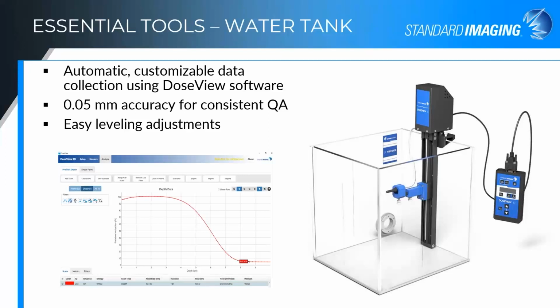Well, okay, so I have a question then. You said that with software, so do you need software, or can you tell me something about our software? Would go with DoseView? You don't have to use the software. You could certainly drive the chamber to the depth, align a surface, set your origin, drive it to the depth that you want to make a single measurement in, and make a measurement with the electrometer as just kind of a standalone system. You don't have to work through the software.